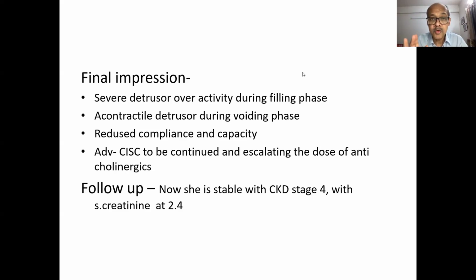If there's no plain film, you will miss a sacral agenesis. And I've shown that slide in previous presentations. Patient with chronic kidney disease, bilateral hydroureteronephrosis due to reflux, operated once, so recurrent reflux, operated twice, another reflux, chronic kidney disease. Out of 3 MCUGs, no plain film.